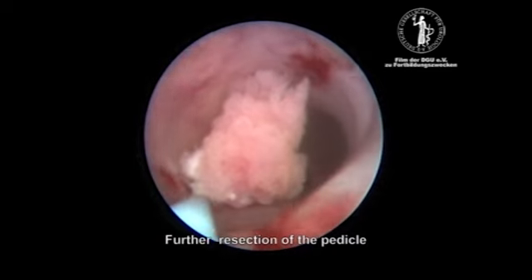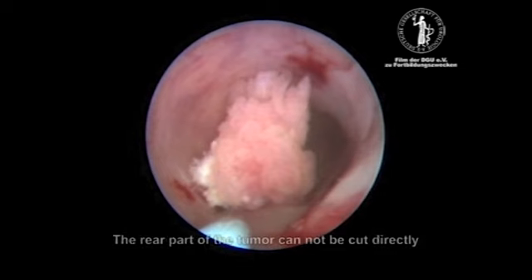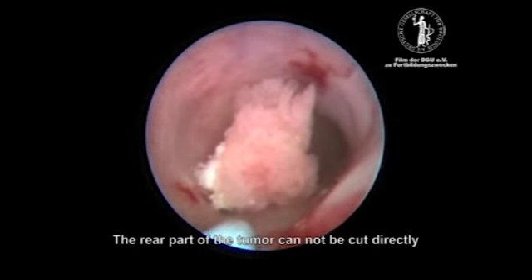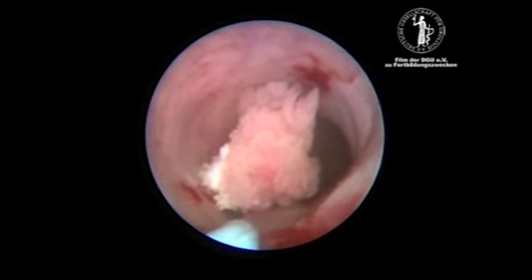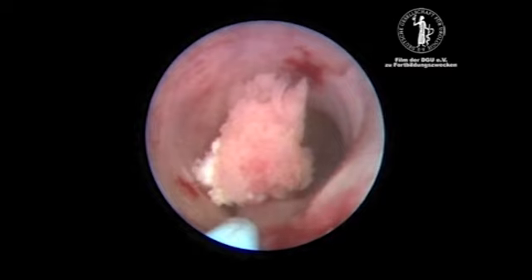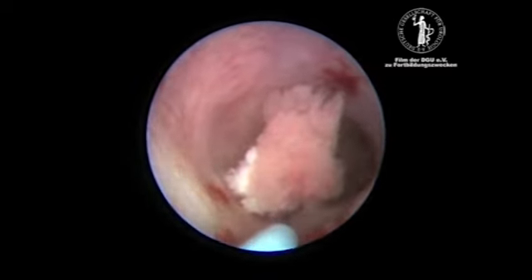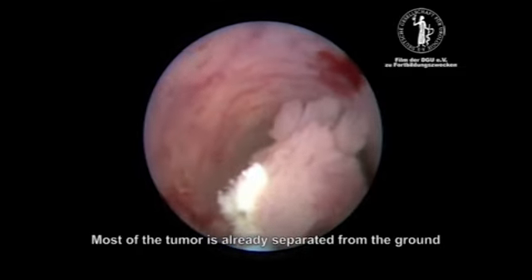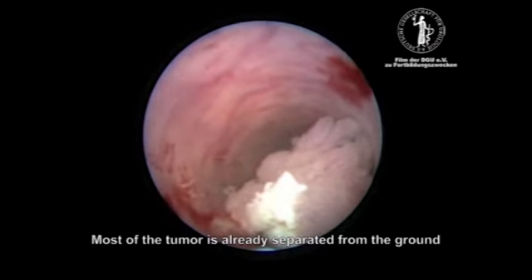Remaining adhesions are divided with laser energy. As you can see, most of the tumor is already separated from the ground.